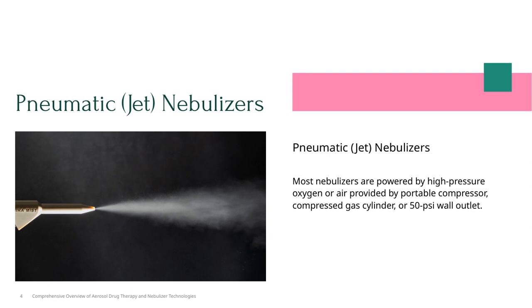Focusing on pneumatic, or jet, nebulizers, these devices operate by using a high-velocity jet of air to create the aerosolized medication. This method has been a mainstay in aerosol therapy for quite some time. Their simple design makes them reliable and effective for delivering medication directly to the lungs. Throughout this presentation, we see how understanding the different nebulizer technologies, including pneumatic jet types, helps us optimize therapy and improve patient outcomes. This foundational knowledge is crucial as we explore more advanced and efficient aerosol delivery systems.